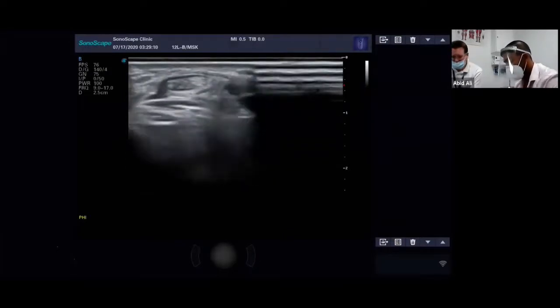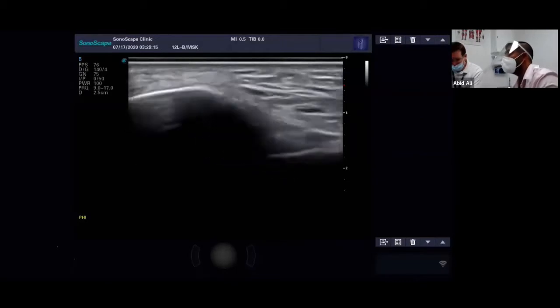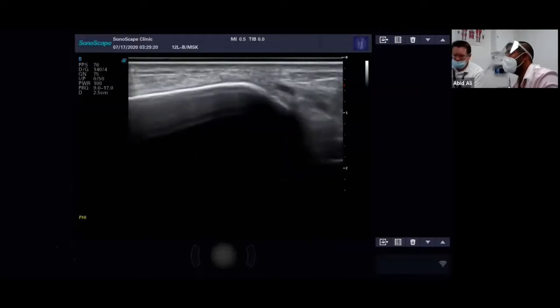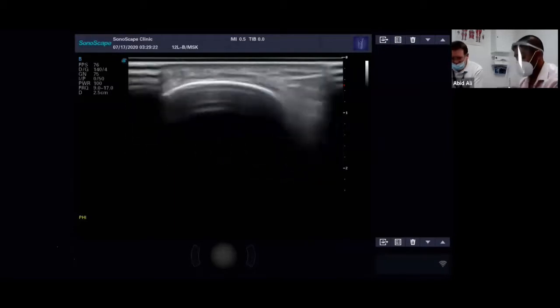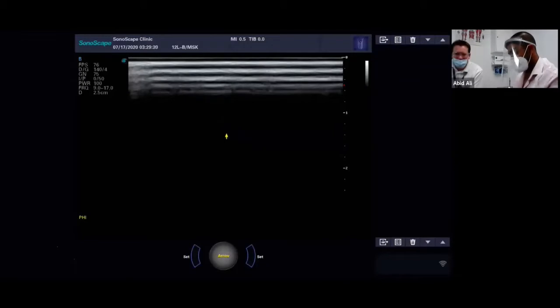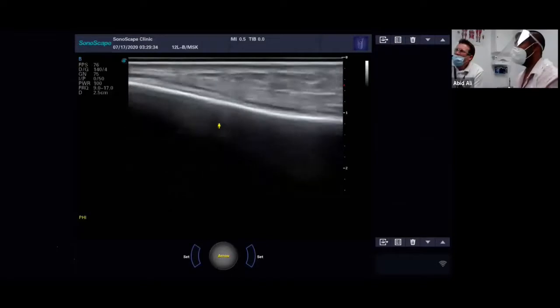Now we're going to scan from medial to lateral in longitudinal. So again, make sure you start on the medial aspect. Here's the tibia. So I'm just adjusting the camera here. I'm just adjusting my probe as well. Get it in position. Apply a bit more jelly. Okay, so we're back on the tibia.